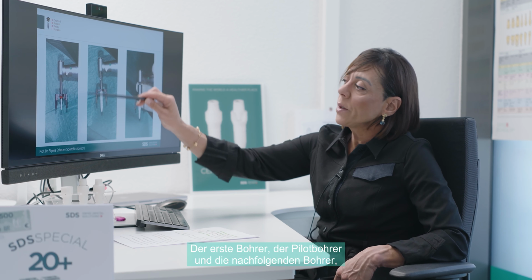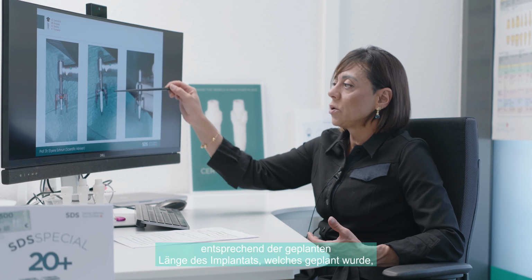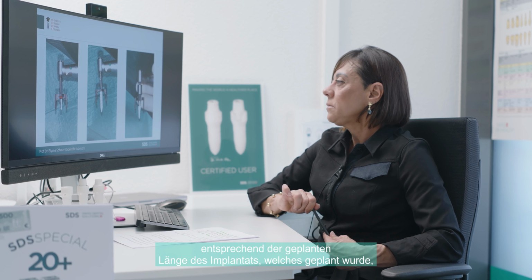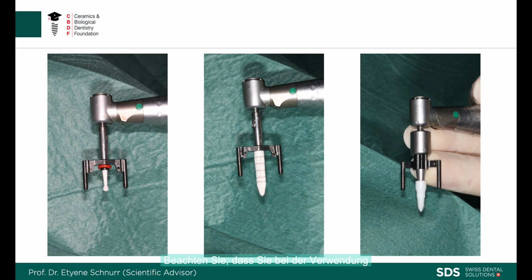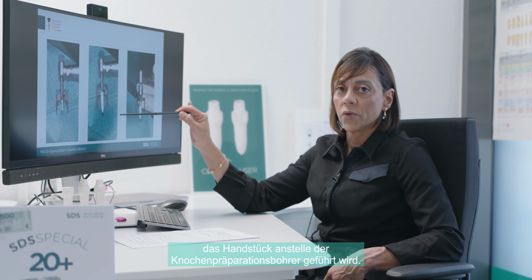as well as all the surgical handpiece guides according to each drill process. So the first drill, the pilot drill, and the subsequent drills according to the length of the implant that was planned, and a handpiece guide for the implant insertion. Note that when you're using a sleeveless open guide surgical system, it is the handpiece that is guided instead of the bone preparation drills.